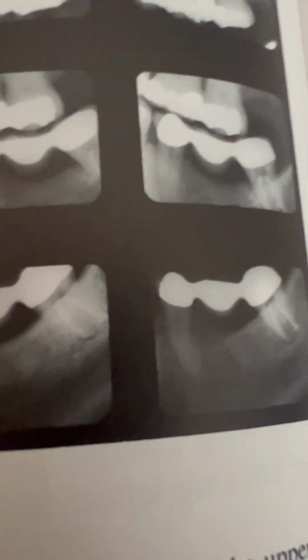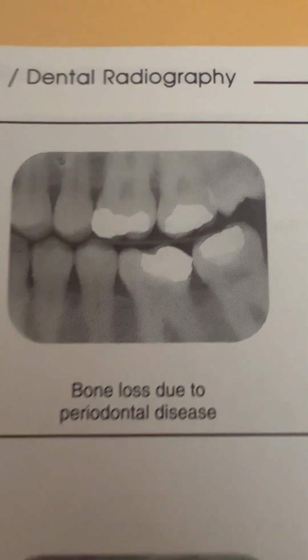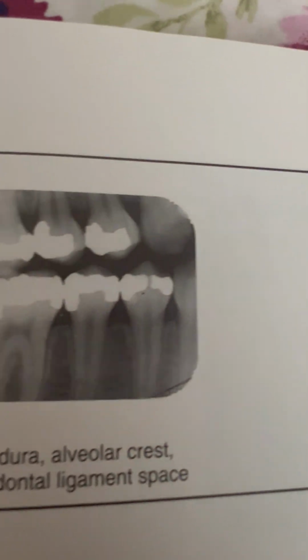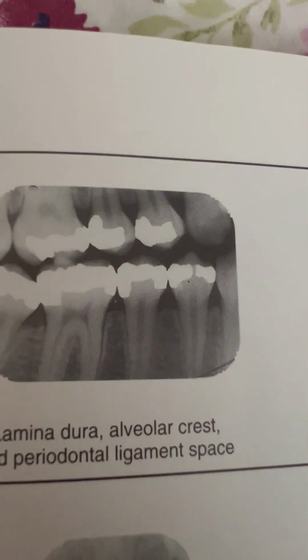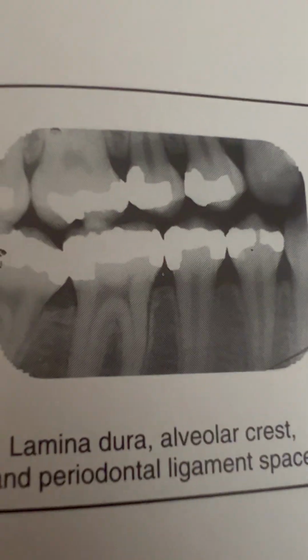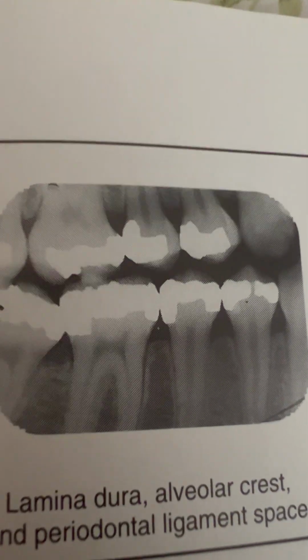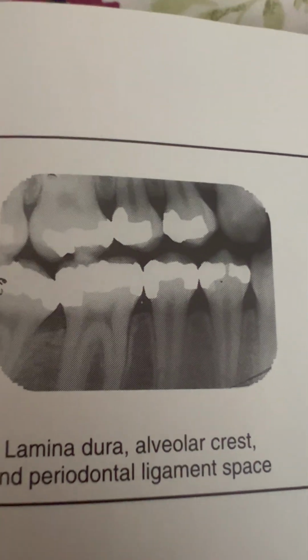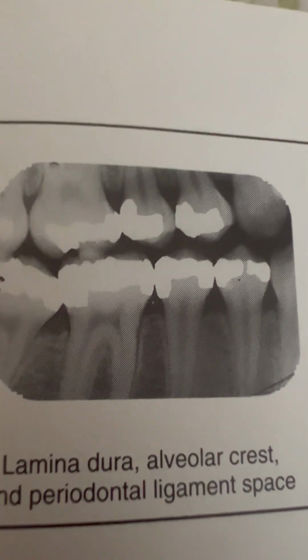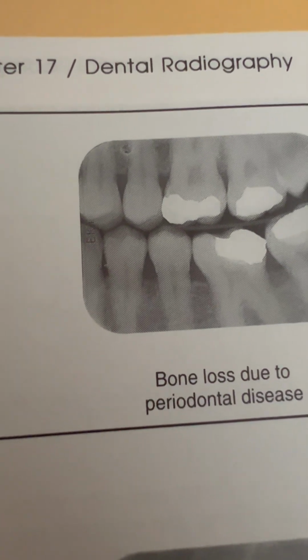All right, so just to give you a bit more summary on the x-rays, what those will look like. Your bite wings, that's where they're looking for cavities in between the teeth. So that's what the bite wings are. When they tell you, go ahead, can you bite down for me and just make a smile but still keep biting, they want to see how you close, or how you occlude, and they're looking to see if there's any cavities in between the teeth.